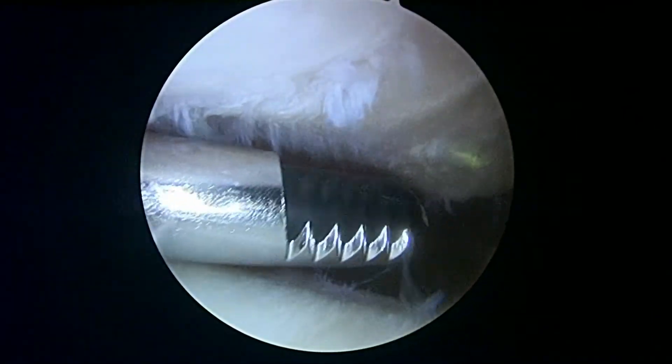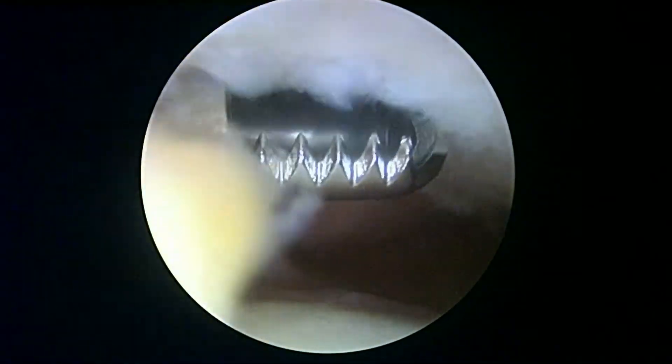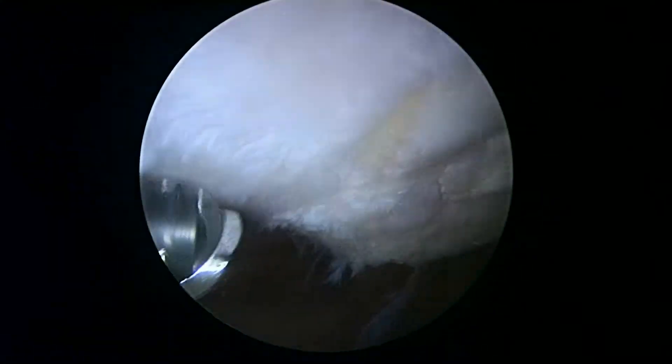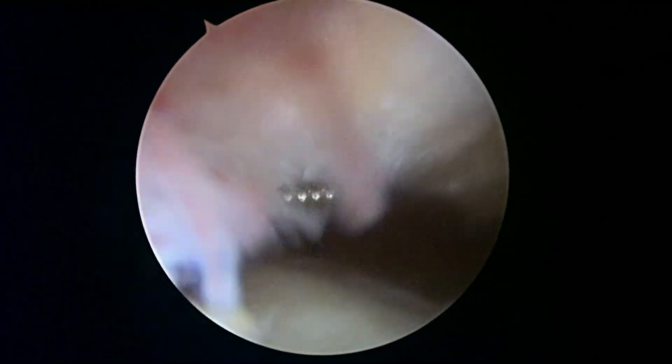Now we're looking at your kneecap at the top of the screen, and this really tells the rest of the story. You're missing essentially all the cartilage underneath your kneecap. You can see these yellowish areas — that's because all the cartilage is gone. And even where there's cartilage left, over here on this medial facet, it's really not normal and is super thin. The cartilage is completely missing as we look at this yellowish area right in the central part of the patella.